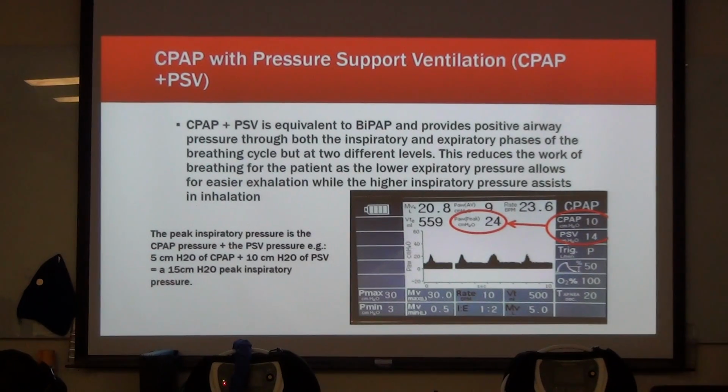This with pressure support is whenever it senses you taking a breath, that trigger, that dip, it's actually going to give you the volume, or not the volume, the pressure, because this is a pressure mode. This is going to give you the pressure that you need, and you're going to sense this this afternoon when you have that mask on.